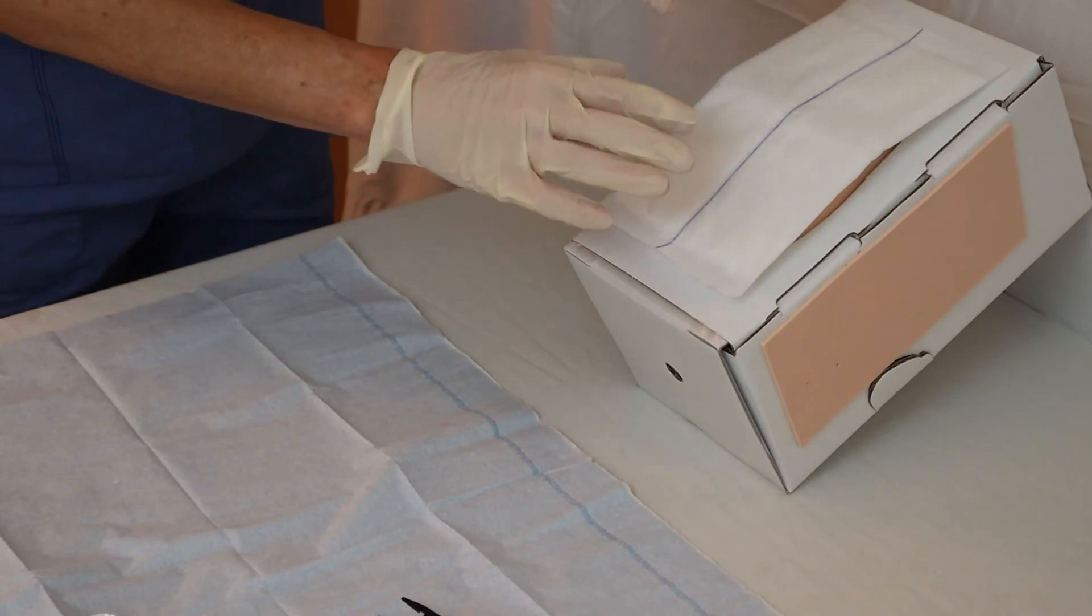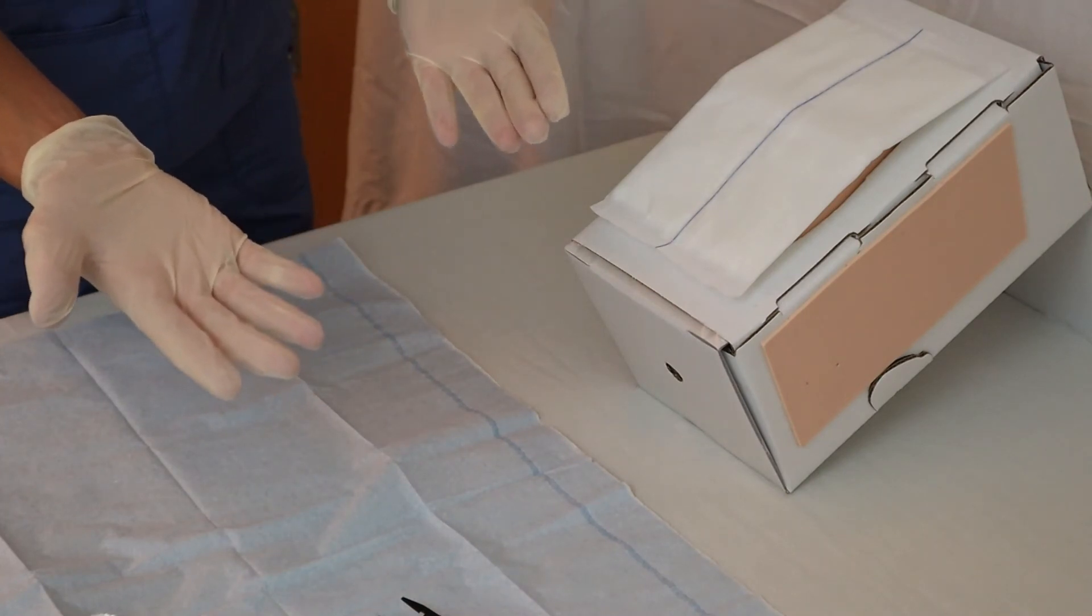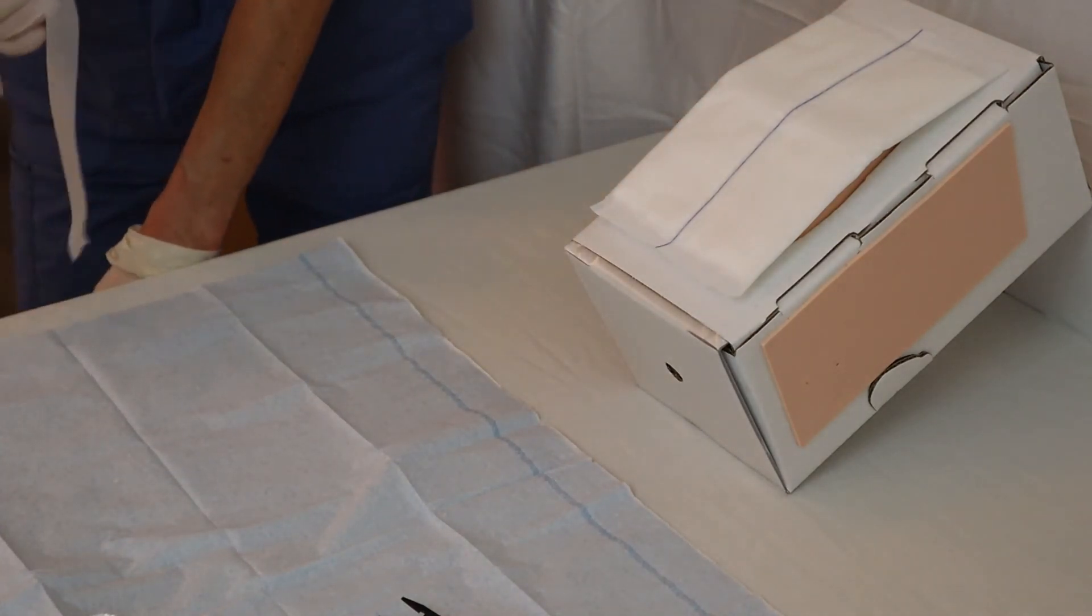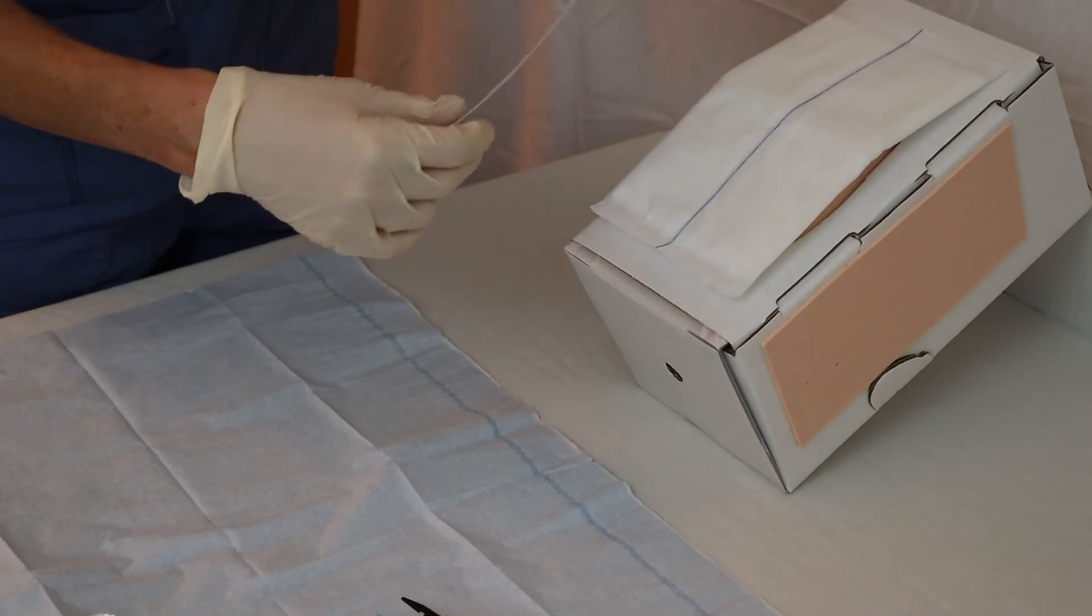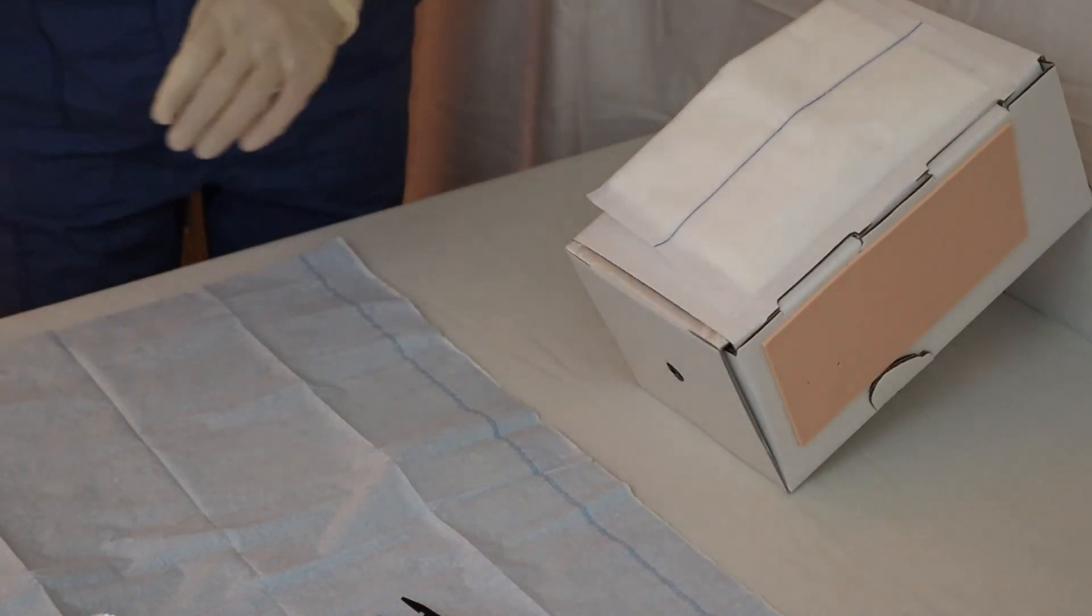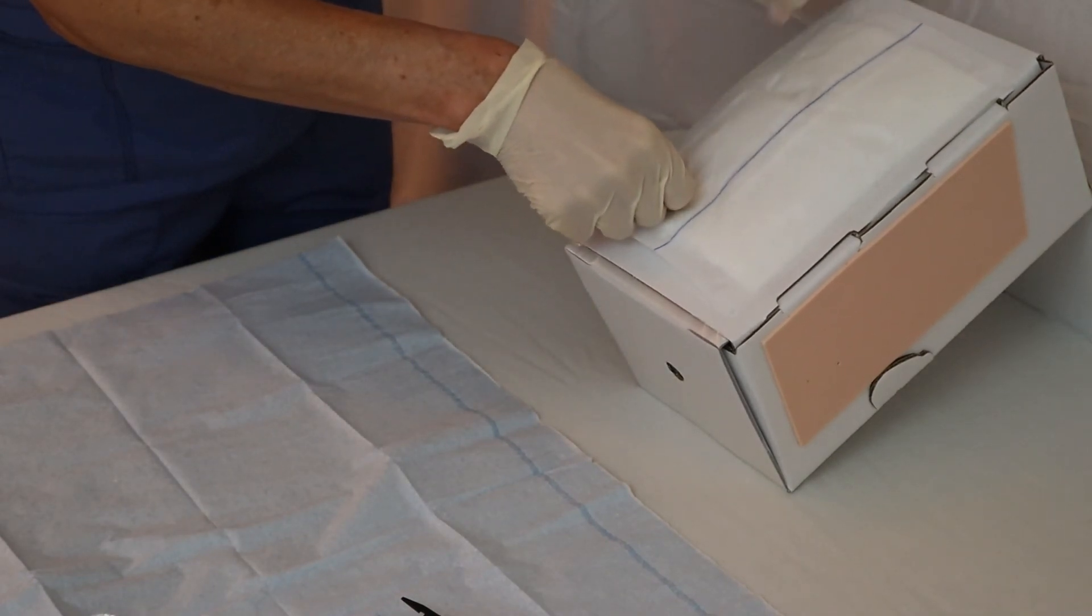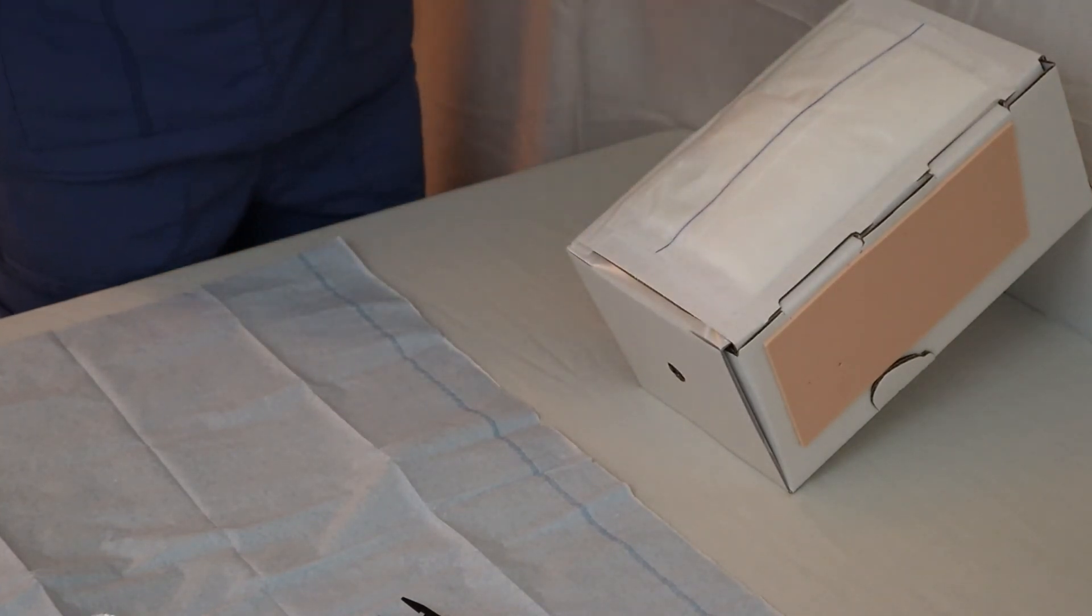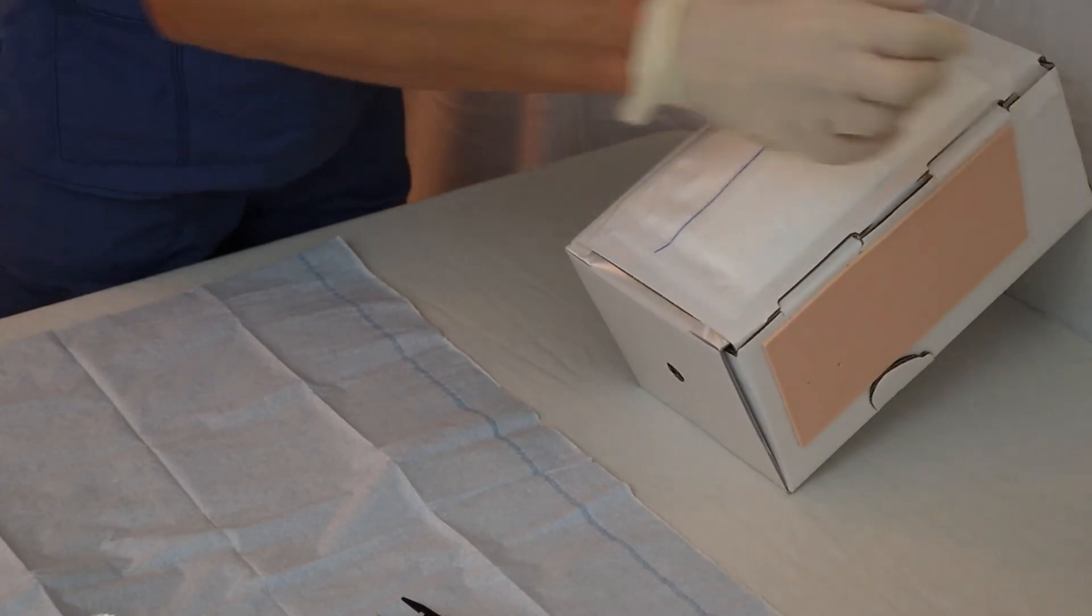Now my sterile procedure is actually complete. I could take off my sterile gloves now but since they're still clean, I'm not contaminated, there's no blood on it. I can now use the tape that I have previously prepared here in the appropriate size strips. Again, I will use a tab here, place it on one side, use the other long strip on the other side, and then my third strip is shorter so it'll go again in this window frame method with my tab.